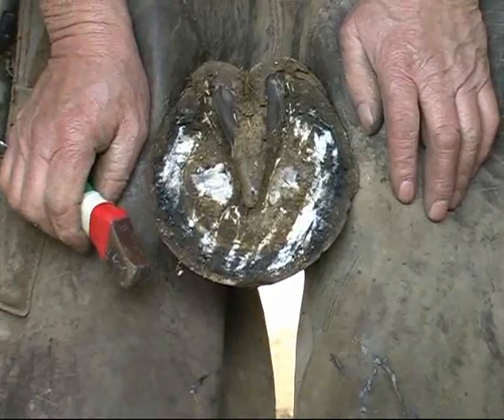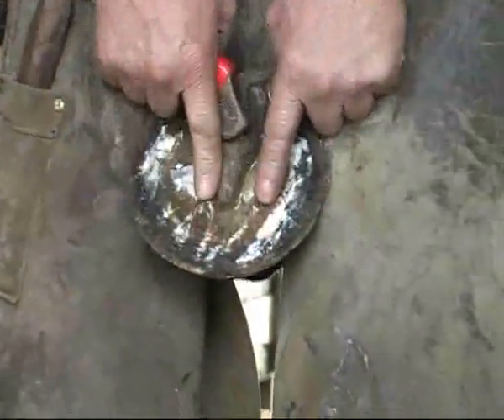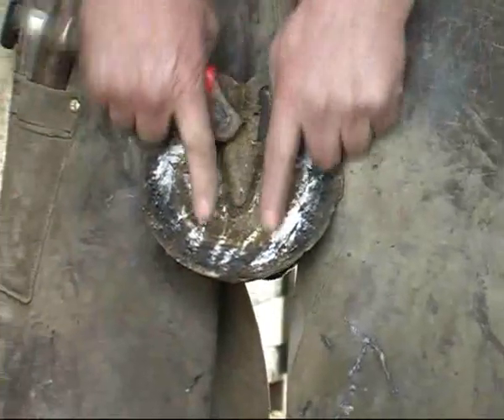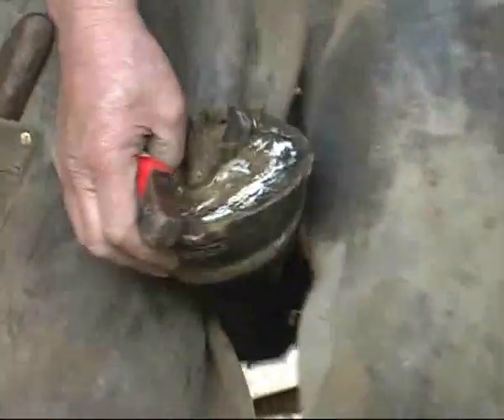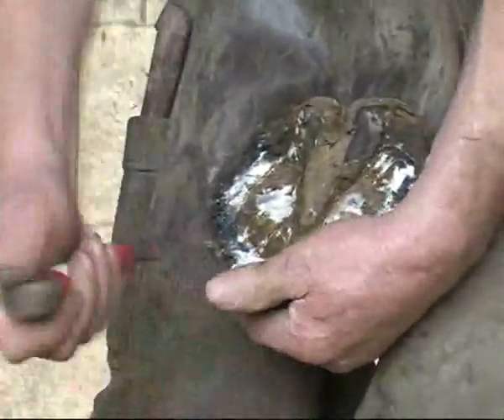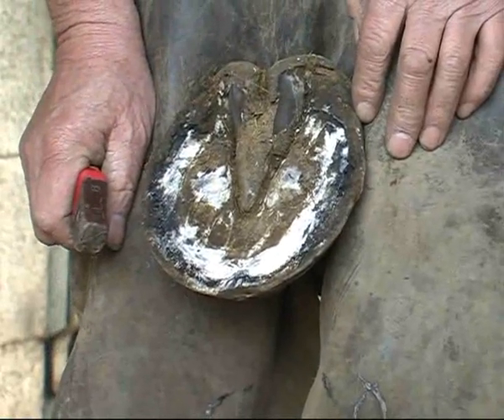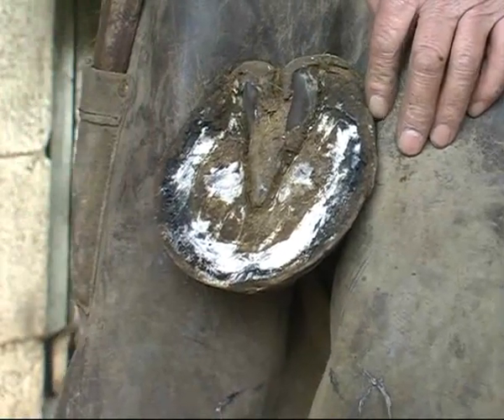The control foot — the foot that we haven't moved the band up and down on — this has not had the band altered in the 28 weeks we've been working on it. Notice this sole is relatively prolapsed here compared with the other foot. The other foot had a nice concave surface. This is still prolapsed and the white zone, by digging, is still very insecure. On day one when we first started this treatment, this foot was not considered critical at all, but it hasn't substantially improved, whereas the other foot that we've moved the band up and down on has.